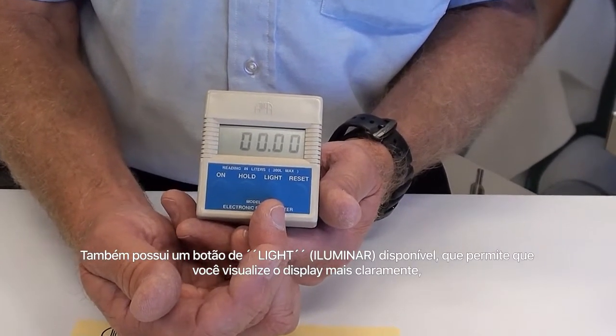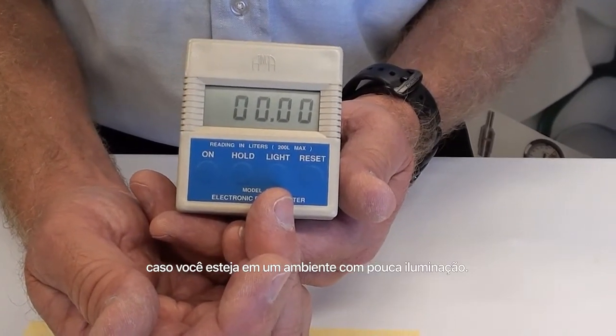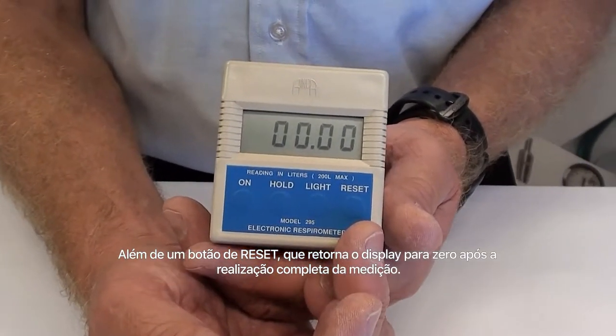There's also a backlight that allows you to see the display more clearly if you're in a low light environment, as well as a reset button which will drive the display back to zero after you've completed your particular measurement.